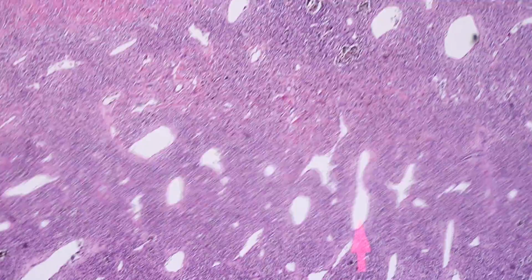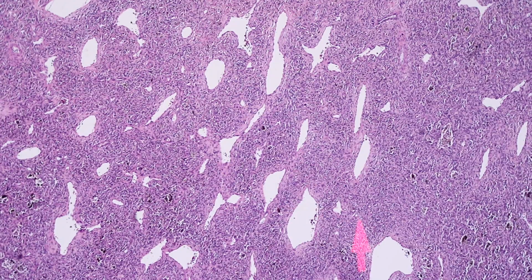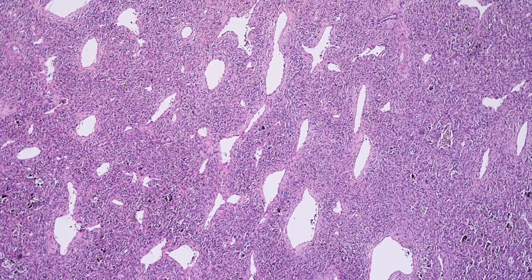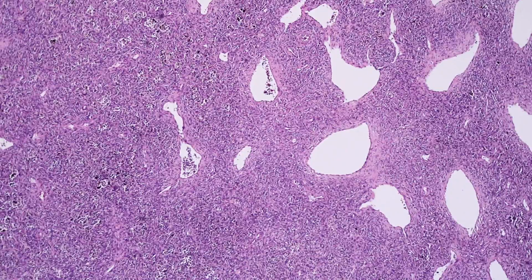First, you'll notice the vessels. Very prominent, dilated, basically staghorn vessels. Yet another reminder that staghorn vascular pattern, or so-called hemangiopericytoma-like vascular pattern, is not specific for solitary fibrous tumor, which used to be known as hemangiopericytoma. So we see this pattern in many different things, so don't get worked up because you see that pattern. It can be seen in lots of things.